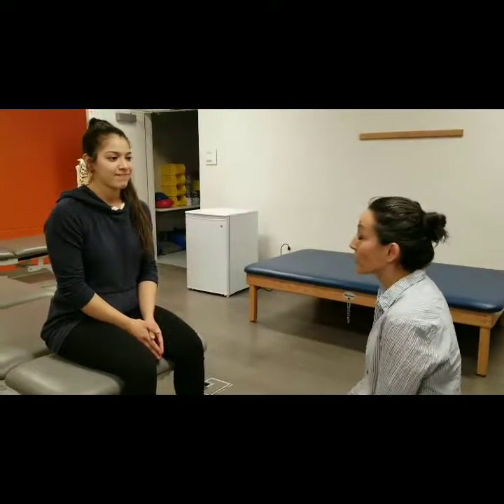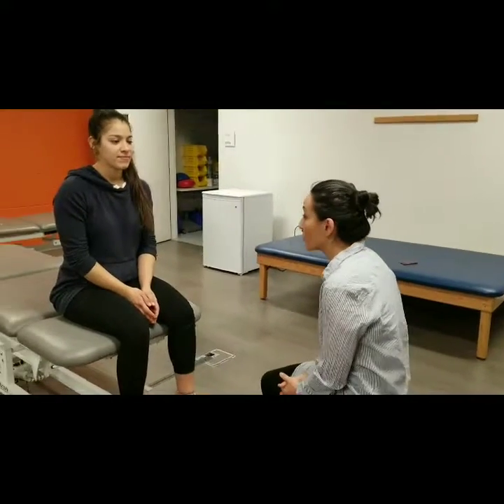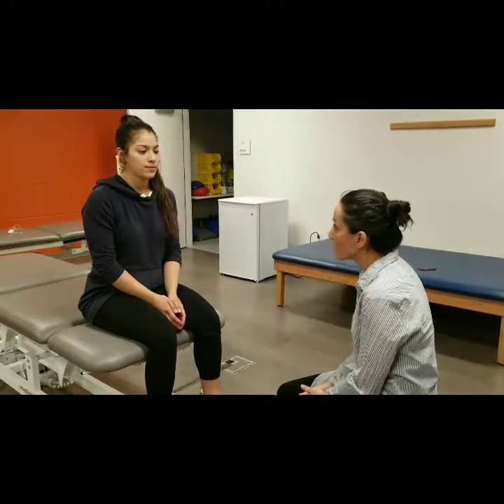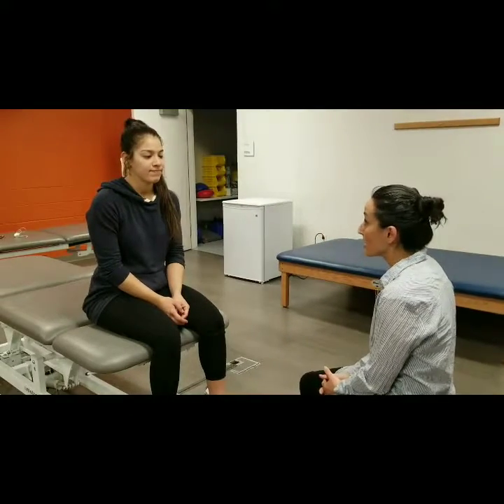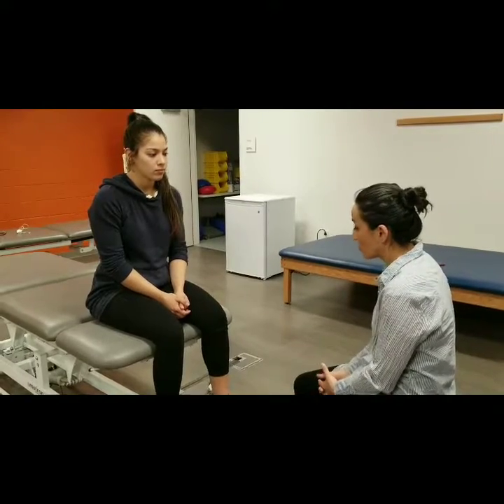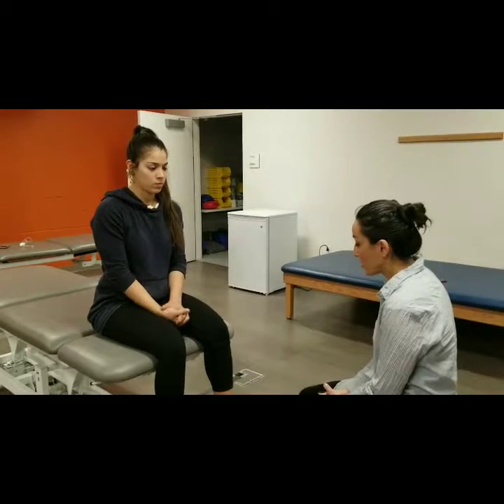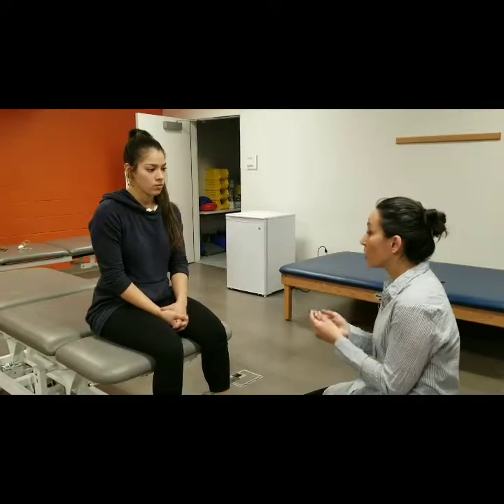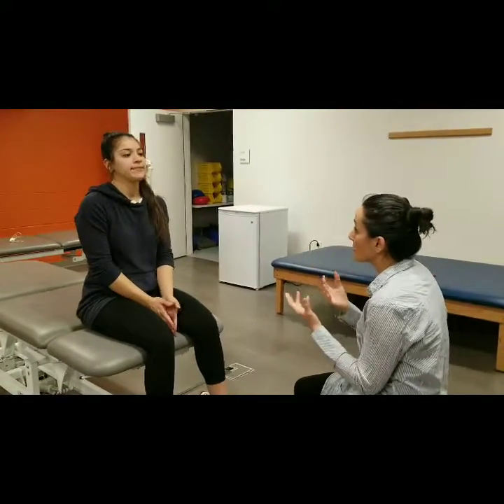Okay, today we are going to apply this compression wrapping on your ankle because you were diagnosed with venous insufficiency disease. When we do the wrapping, it will help with the edema that is occurring there. Besides the wrapping, you need to elevate your foot higher than your heart when you get a chance.